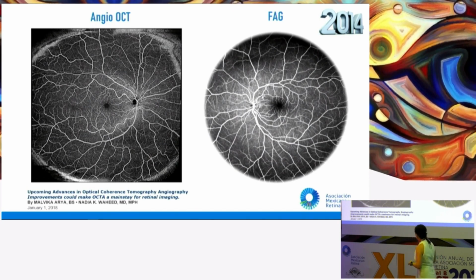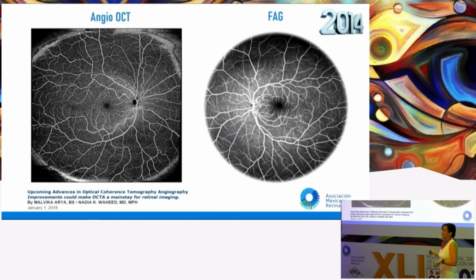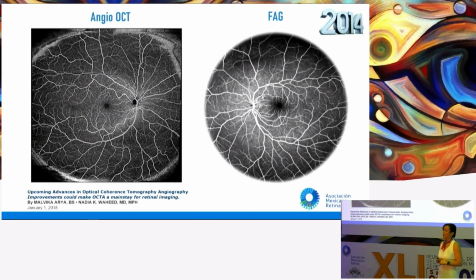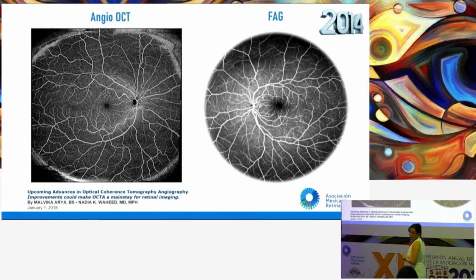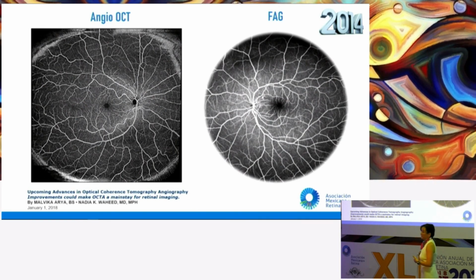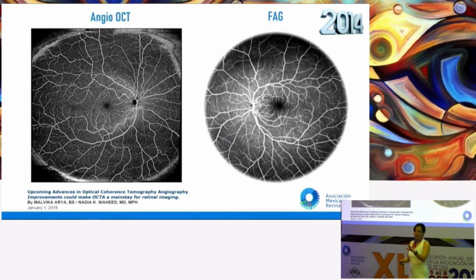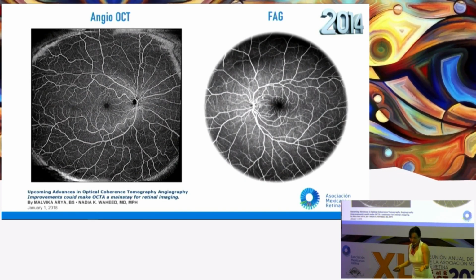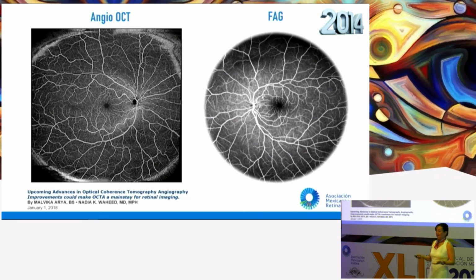bias, and I underscore the term bias, I show you this slide and I say, this is the fluorescein angiography. And in this case, you have an angio-OCT. Could your eyes notice the difference? You might as well say they are almost alike. But then I say, here I had to inject contrast medium on the patient, but not in this case. Again, there's bias. This is a paper in 2018 that talks about what could be the case with angio-OCT.